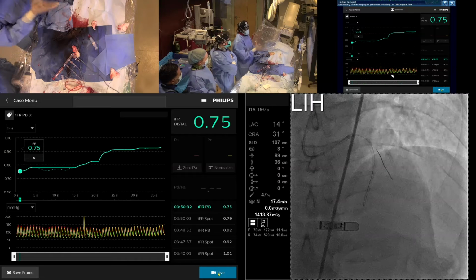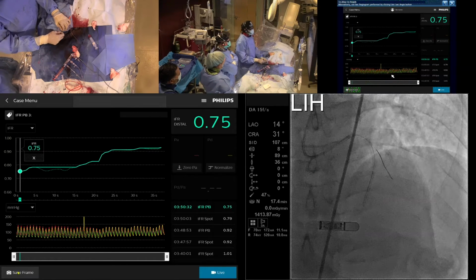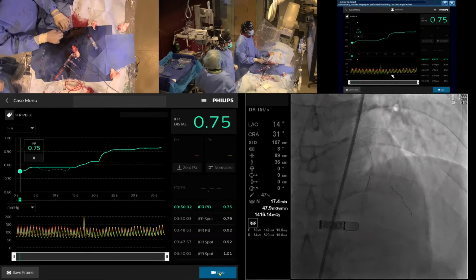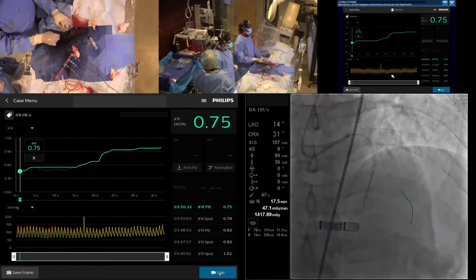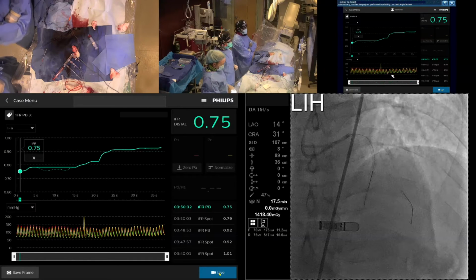So why don't we do this? What a great example. Let's dilate the ostium so we get something delivered, and then let's fix it, right? Yeah, I think so. And then we can just use a small balloon up top to deliver some equipment and fix the stent. Do you want to do a 2.0 balloon or 2.5? 2.0 is fine. I just want to be able to deliver a stent. That's it. So let's have a 2.0 by 15 balloon.